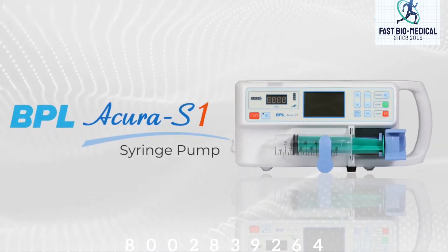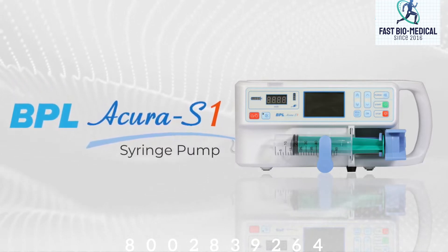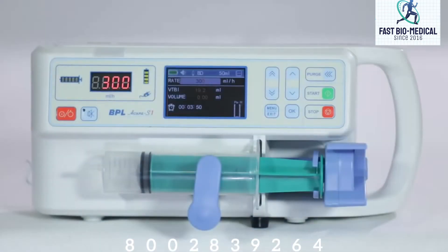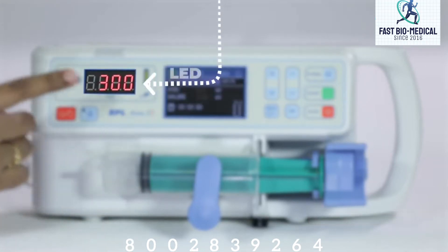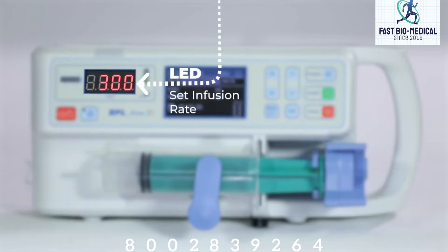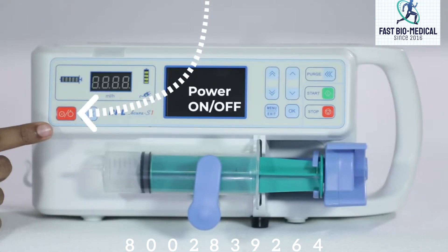The BPL Acura S1 syringe pump is a fully featured syringe pump suitable for critical care and general infusion applications. The pump has a 2.8 inch color LCD screen and an LED which shows the set infusion rate. This is the power button to switch the syringe pump on and off.